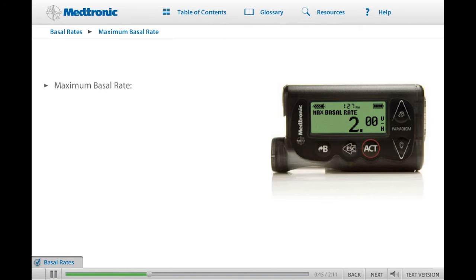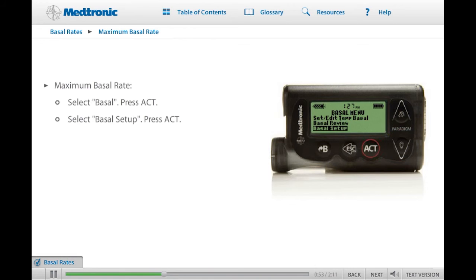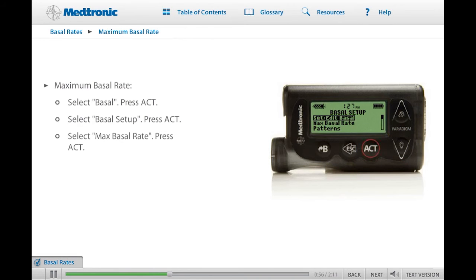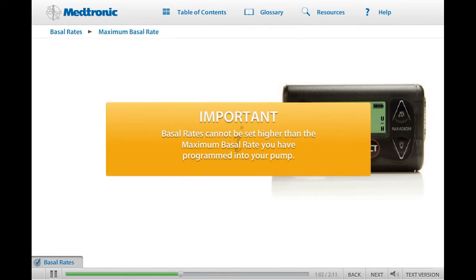To set or change a maximum basal rate, select Basal on the main menu and press ACT. Once a maximum basal rate limit has been programmed into your pump, you will not be able to program any basal rate, including a temporary basal rate, for a higher amount than the amount you have set in your pump.